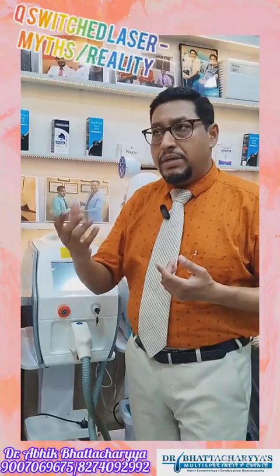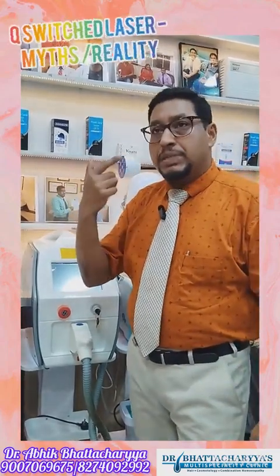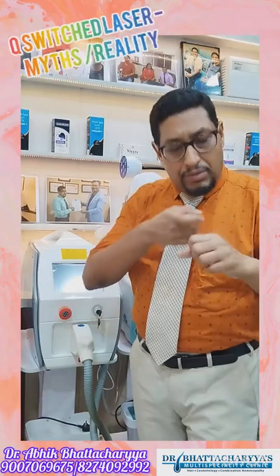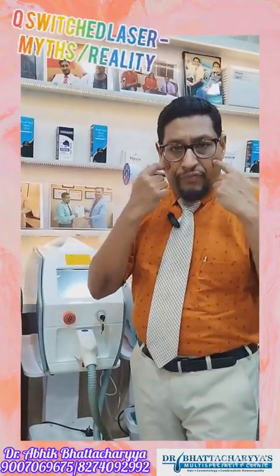The laser carbon peel is totally painless, but tattoo removal, birthmark removal, pigmented lesions, freckles, or melasma treatment slightly need anesthesia, because when the laser hits, you feel some amount of pain, and there is also inflammation. The laser carbon peel doesn't have any inflammation.